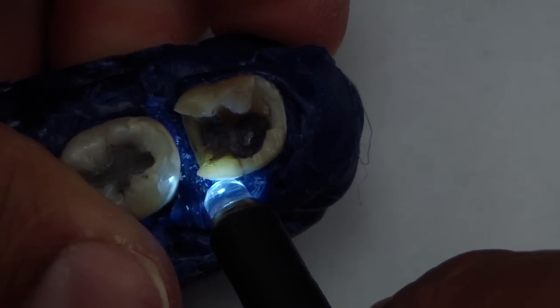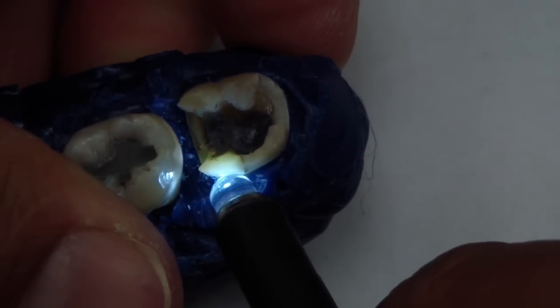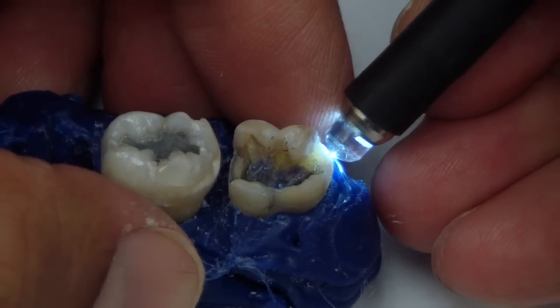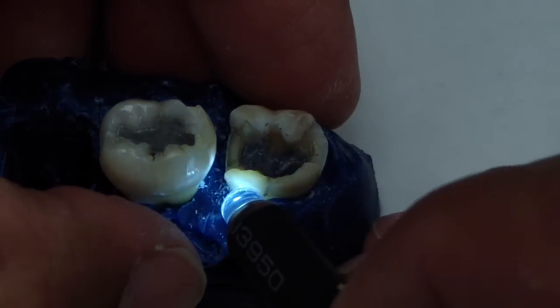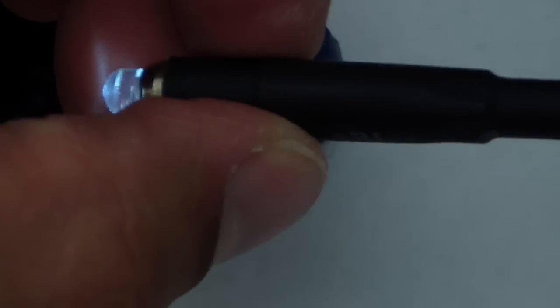So what we do here is really take that into consideration and place a cuspal coverage restoration, whether it be an amalgam. I've shown the cuspal prep already. These are just a little tip — when you're preparing these teeth, if you do see something like that, maybe just use your handpiece light, or if you have a $5 LED bore light, kick it around.